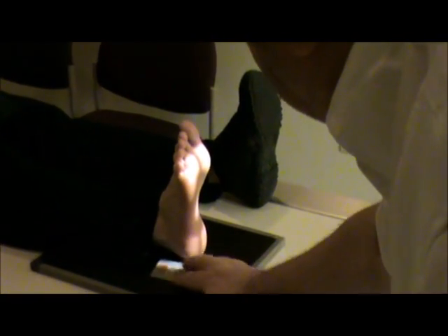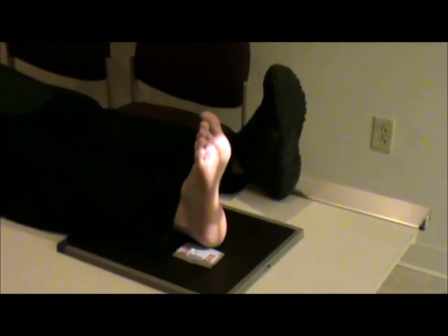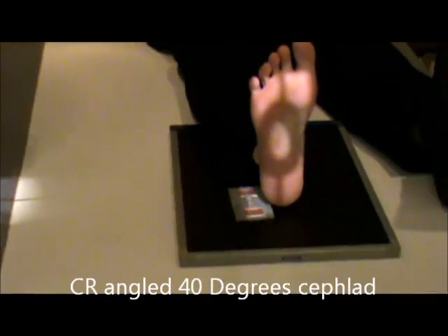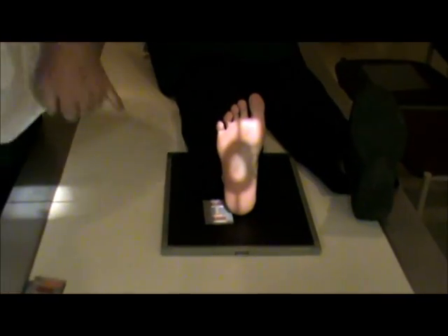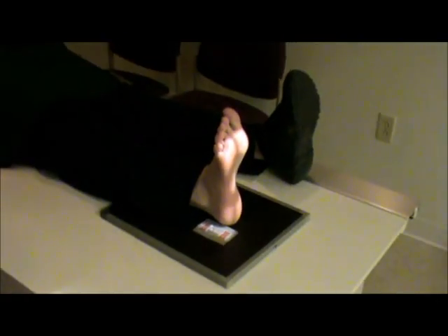I'm going to put my marker here, leaving room on the side for it. This is going to be our axial projection, or plantar dorsal projection, for the calcaneus. The tube angle on this is going to be 40 degrees. We're going to center to the third metatarsal, and you should see it projected down the center of the calcaneus as it goes onto the film. And this is our axial projection for the calcaneus.